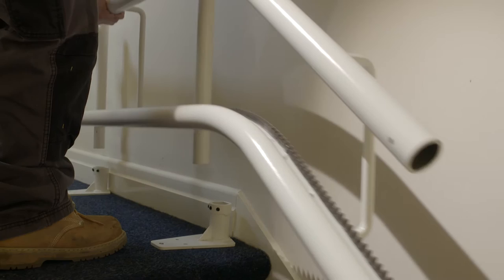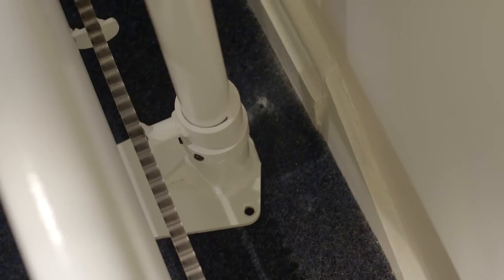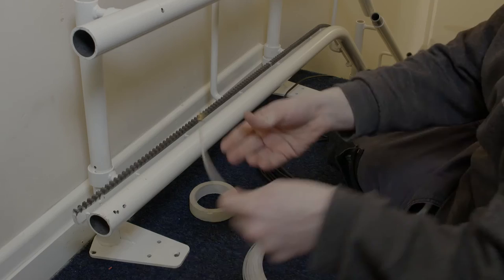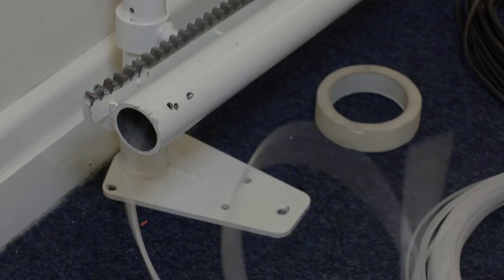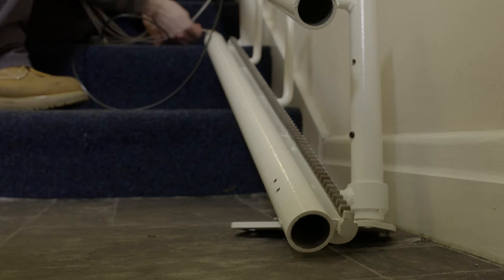Starting at the top of the stairs, place each rail section on the stairs in the correct leg base. Using the cable feeder, start by feeding the 2 core charging cable through the lower tubing of each rail section, starting at the top and working down. Ensure a minimum of 150mm of cable at each end.